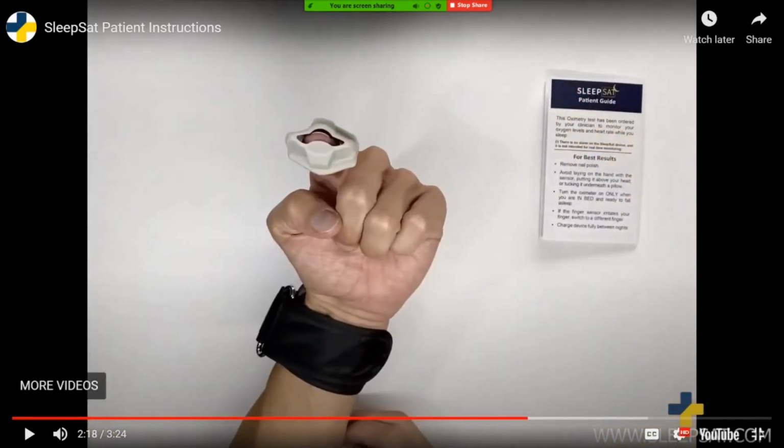All right. This is a perfect image of what it looks like when the patient's finger is inserted into the probe. As you can see, this little tab at the end of the probe, the patient's finger should be touching that tab. It shouldn't be completely folding it over, and the patient's finger shouldn't just be floating in the middle of the probe.